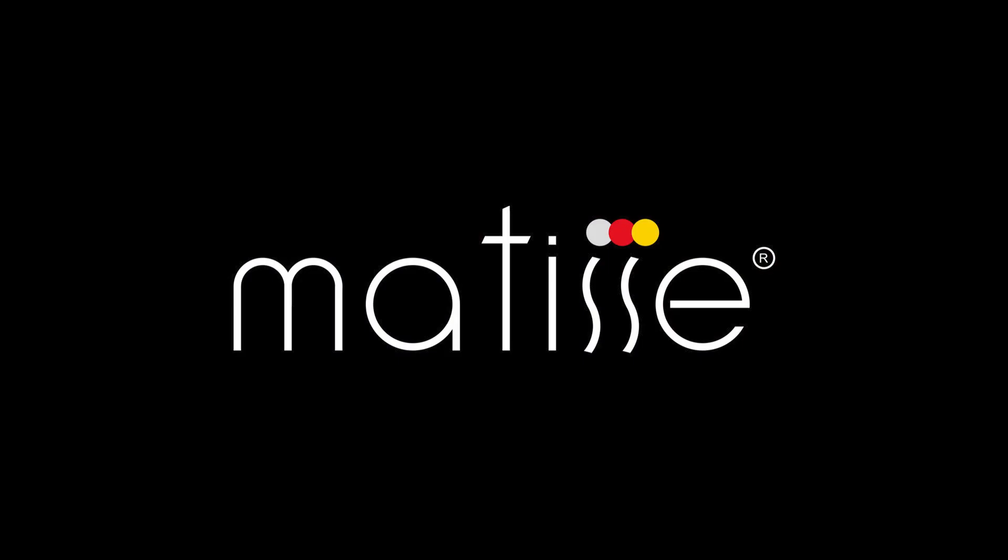Matisse works like magic. In this video I'm going to show you how to make an aesthetic model using Matisse color model resin.